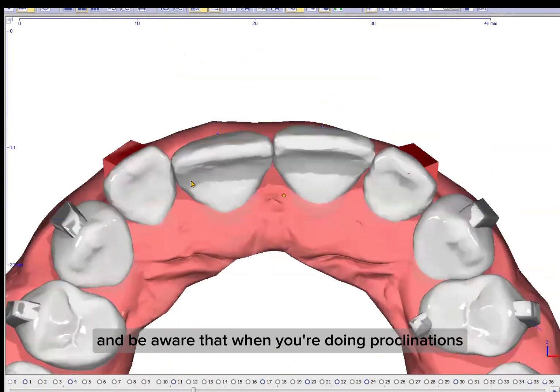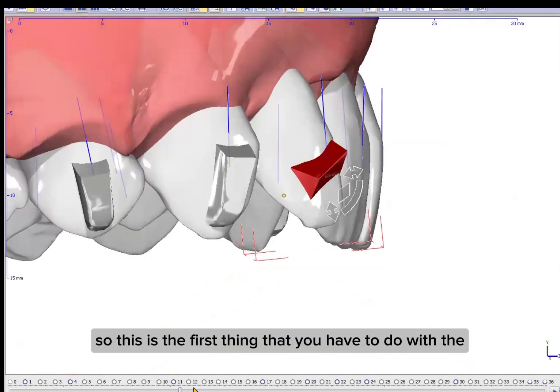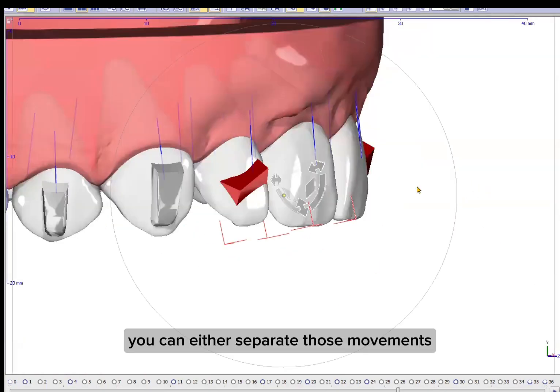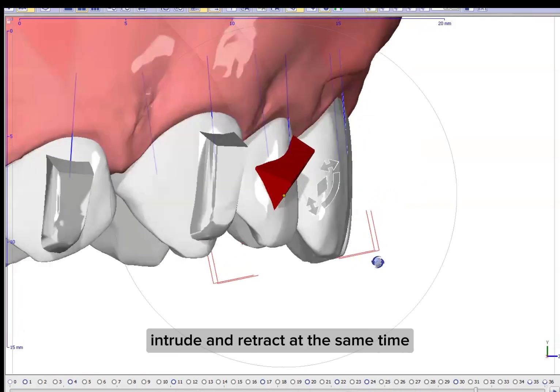Be aware that when you're doing proclination, you're not going to have many collisions because proclining is going to give you space. So this is the first thing that you have to do with the anterior teeth — then you need to intrude them and retract them. You can either separate those movements if you have too much intrusion and retraction, or you can intrude and retract at the same time.